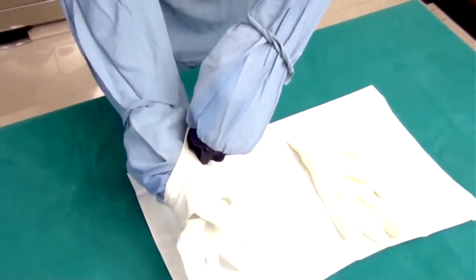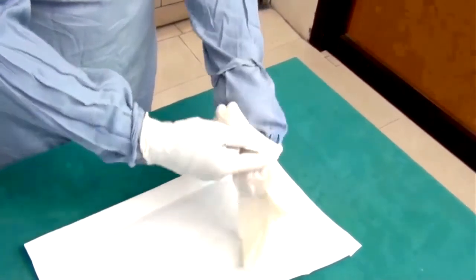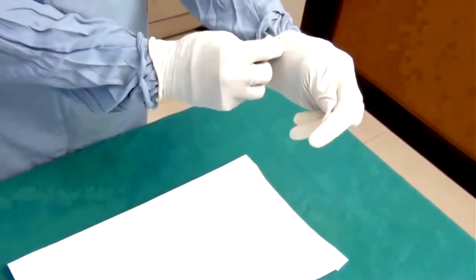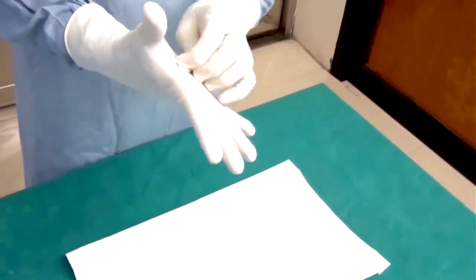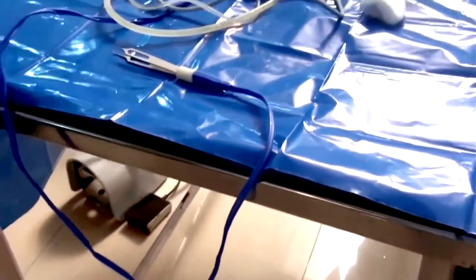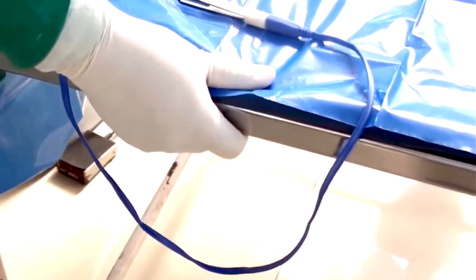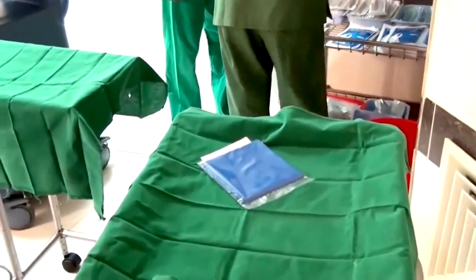This can be done for the surgeons, once the staff is already trained. Now the last method is the totally non-touch method, where the gown is covering your hand and you glide your glove onto it and then pull your gown outwards. This is the totally non-touch method. Now after this, if you are very careless, if your tubing is outside your sterile field and hanging like this, the whole purpose is lost. So you have to be very, very careful in introducing sterile instruments into the sterile field.